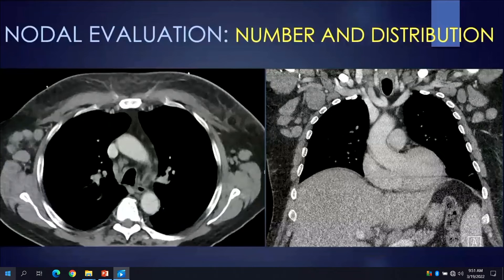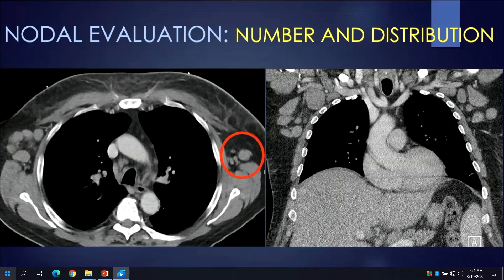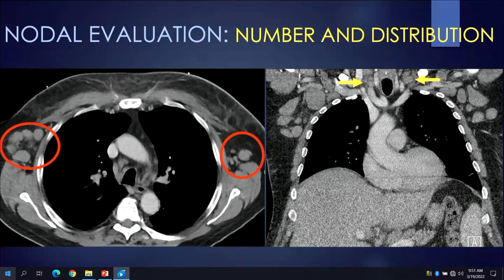The next characteristic to consider is number and distribution of lymph nodes. A single enlarged left axillary node might, based on our knowledge of lymphatic drainage pathways, lead us to consider a condition involving either the left upper extremity or anterior chest wall. However, given that this patient has bilateral axillary as well as neck nodal disease, we now have to consider more diffuse or systemic processes, such as hematologic malignancy in this particular case.